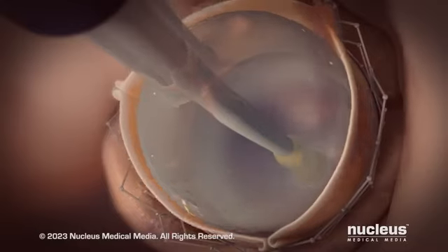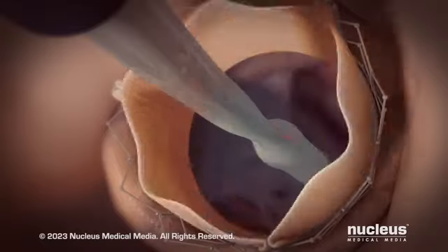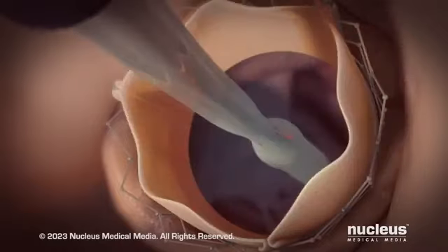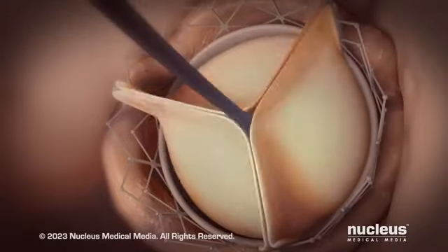After placement of the new aortic valve, your doctor will deflate the balloon. The stent will support and secure the replacement valve in place. The catheter and guide wire will be removed.